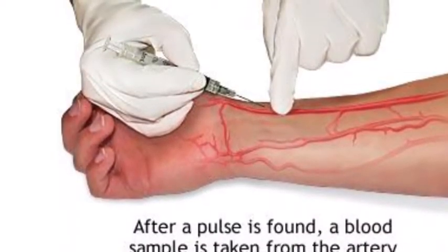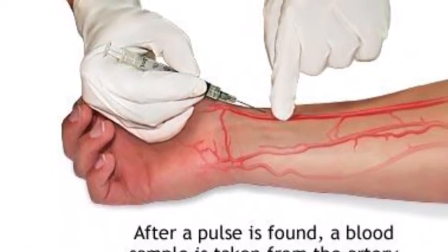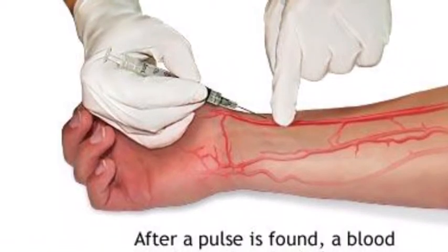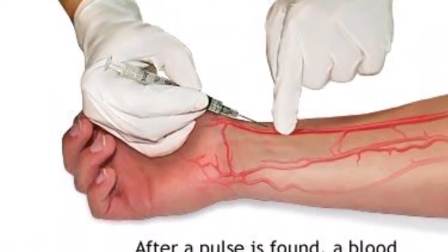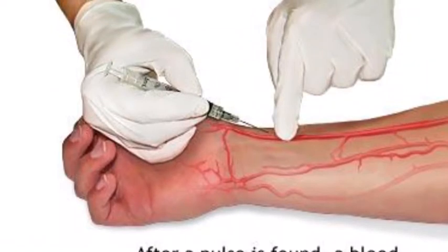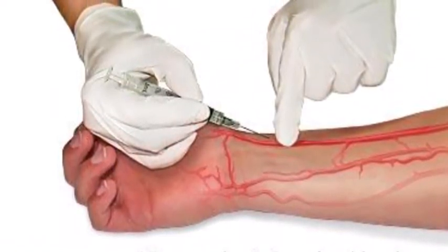Alrighty, a contraindication for an ABG is a failed Allen's test. You need to find a different puncture site. So if you do it on the right hand, you need to switch to the left. It can't be performed on a limb with a distal surgical shunt or lesion. Need for monitoring the femoral puncture site for extended periods of time, which means you should not be performing ABGs outside the hospital.